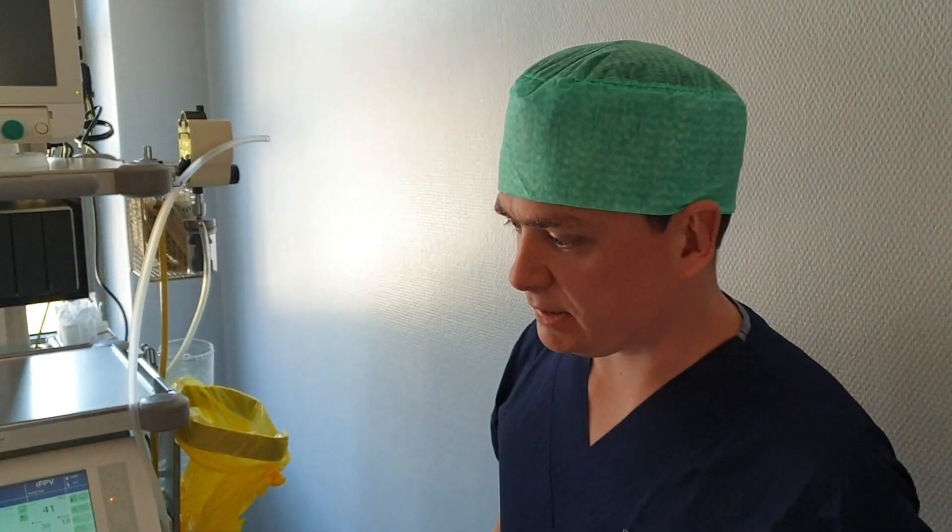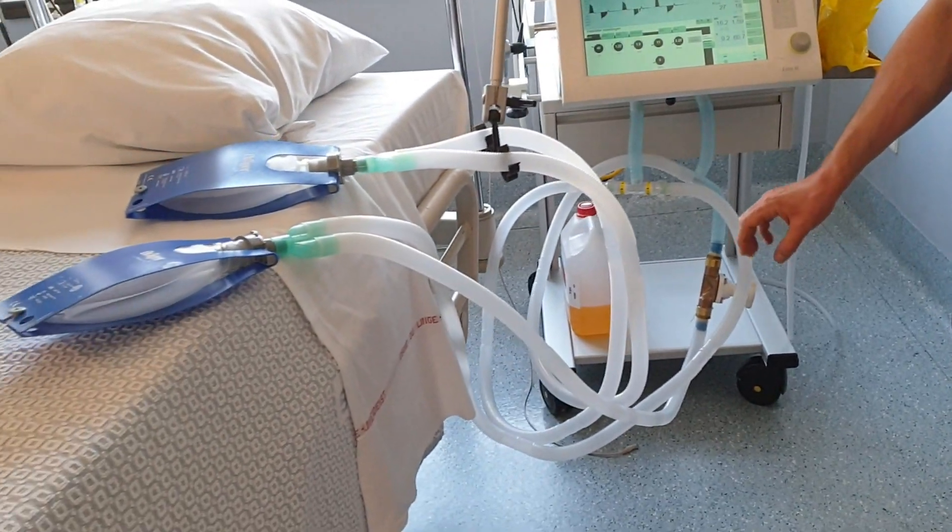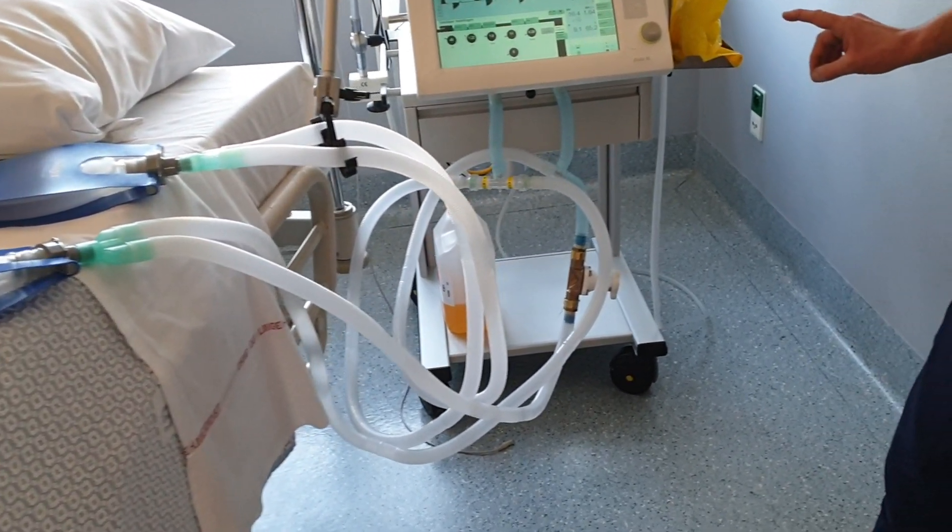Hello, I'm Dr. Mathias Merger, Intensive Care Unit Hospital Gale, Belgium. We made a setup for ventilating two or four patients on one ventilator.